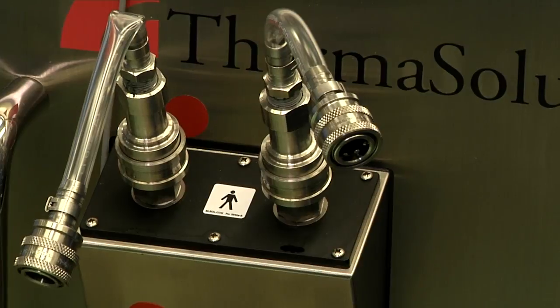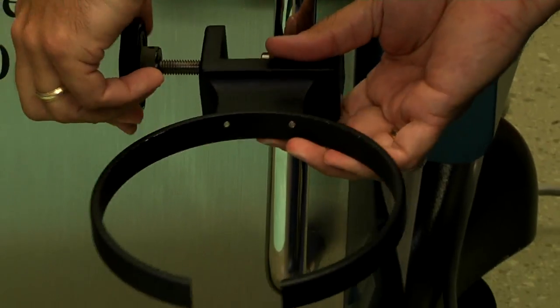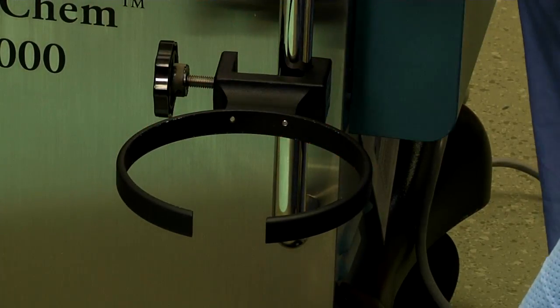The final component is the reservoir bracket, which will fit on the side rail and we place it lower on the bracket. And those are all the hardware components that get assembled on the HT2000.